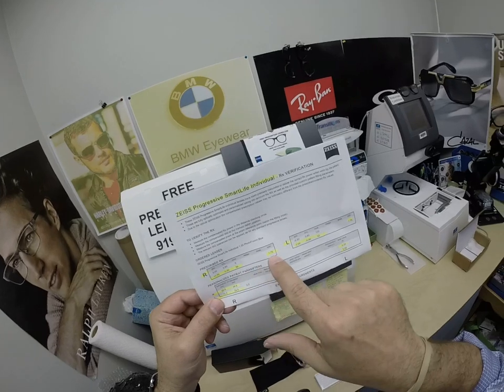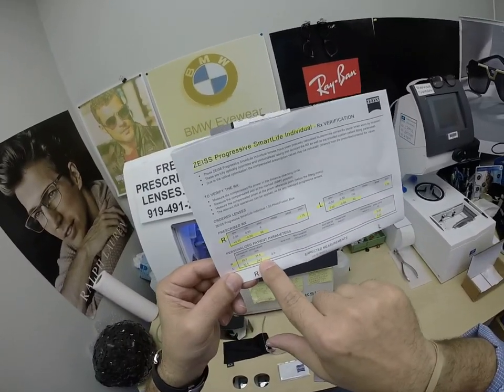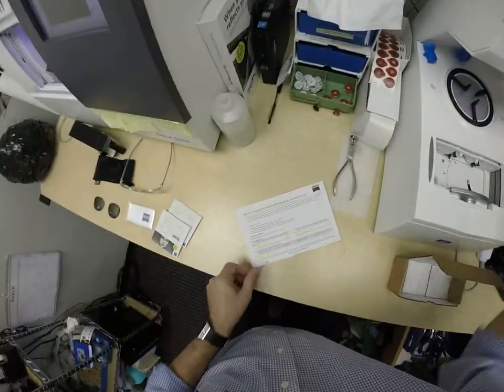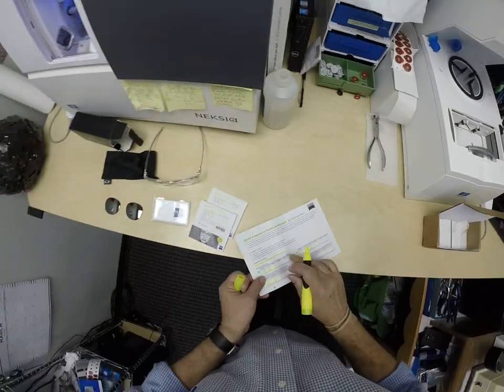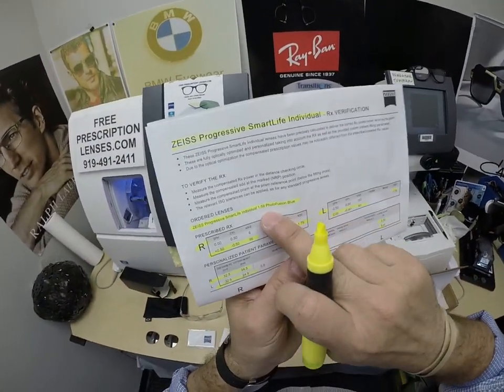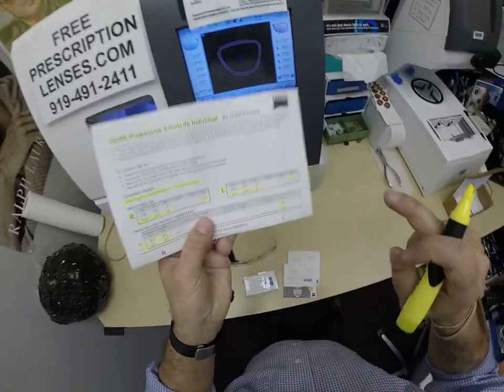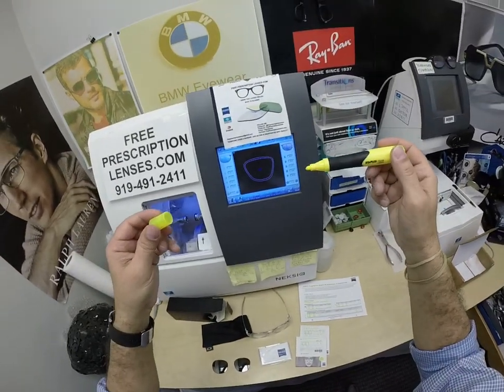I've highlighted the prescription for the right eye and add power, same for the left eye — add power, pupillary distance, optical center height, base curve of the lens. These are the Individual 1.59 — the refractive index for polycarbonate — the Photofusion Blue, and he even got the Zeiss Blue Protect anti-glare coating.